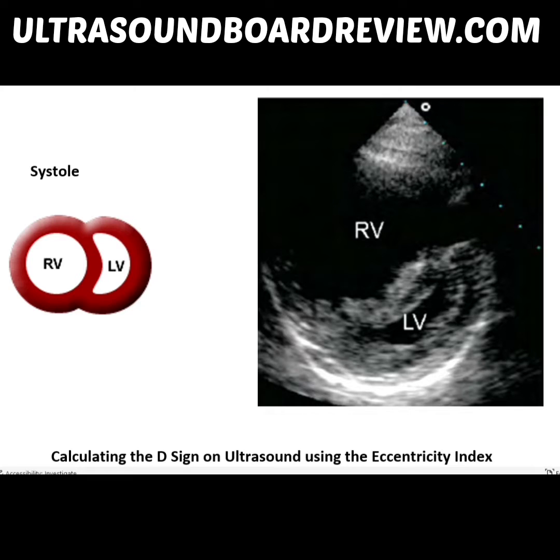But in systole and diastole, it's more important to see a flattened septum, in both cycles, correct. And in RV volume overload, you'll see a flattened septum only in diastole, not systole. It's very important to understand that it's impossible to have a flattened septum in systole and a round septum in diastole.